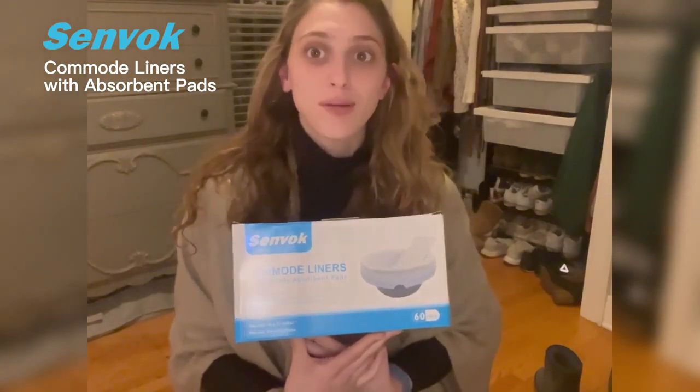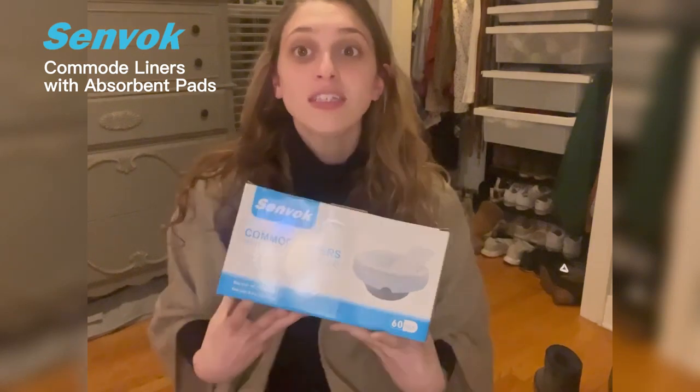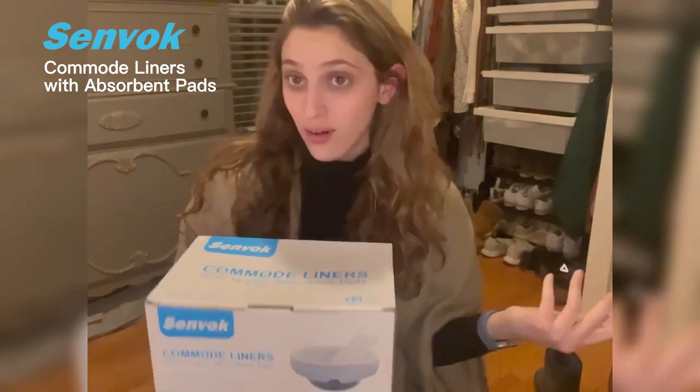Hi guys, today I'm going to be talking about these commode liners that I received, and I'm going to tell you how to use them and what they can be used for. First let me show you what comes on the outside of the box — this is really great because it comes 60 to a pack, which means it'll last you a really long time.